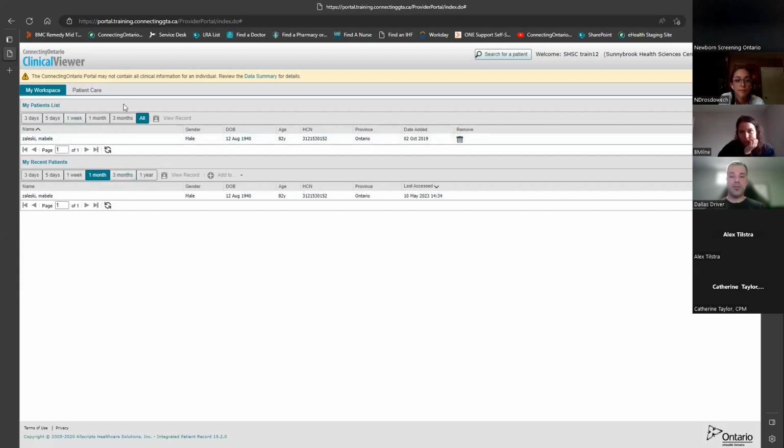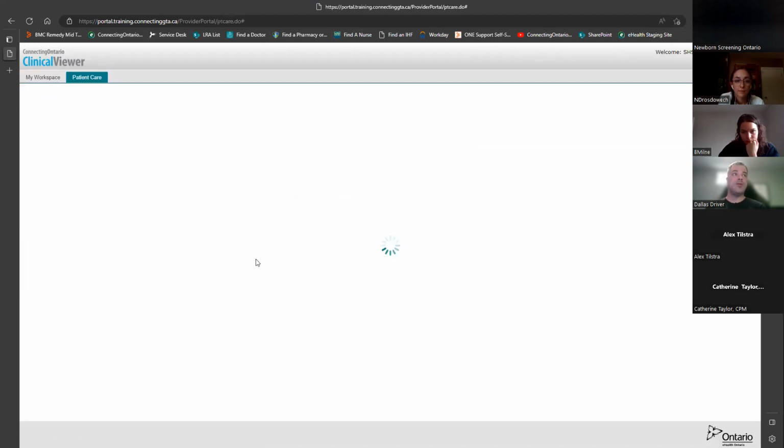So if you're looking for information on these patients on a regular basis, you can come straight to here and review the demographic information, again, just to make sure that you're selecting the right patient before you go ahead and access their record. So I'm going to double click this one, and that's going to take us through to one of our test patients, which is Mabel Zaleski.